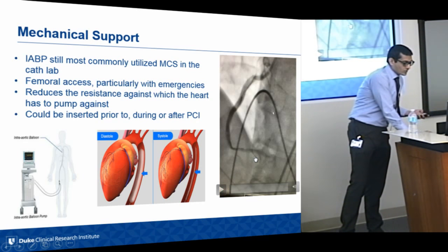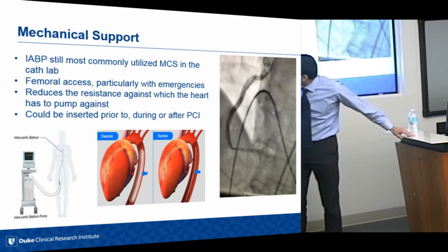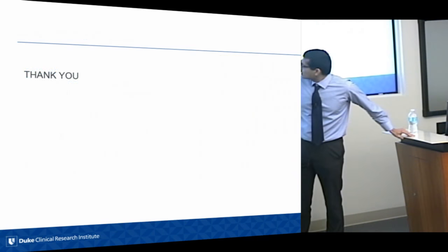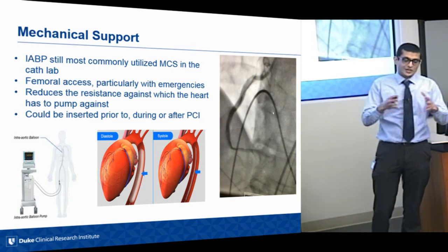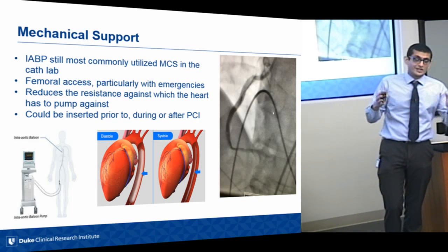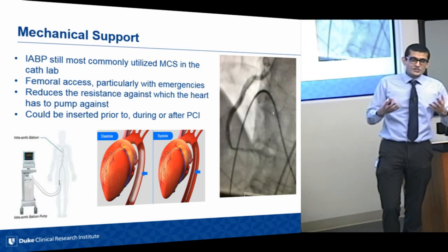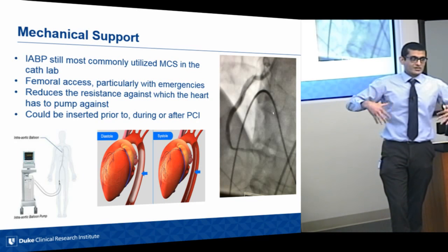And this is kind of what it looks like. Not sure it's going to play, but essentially I think it's in the corner here. This image is not going to play, but essentially it's a helium pump that inflates and deflates with systole and diastole. So it comes in 3 sizes. It essentially depends on the volume of helium in there. We usually choose it depending on the size of the patient.